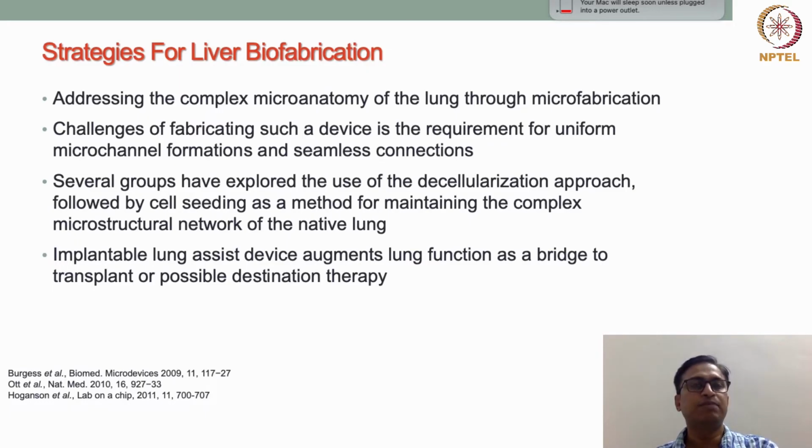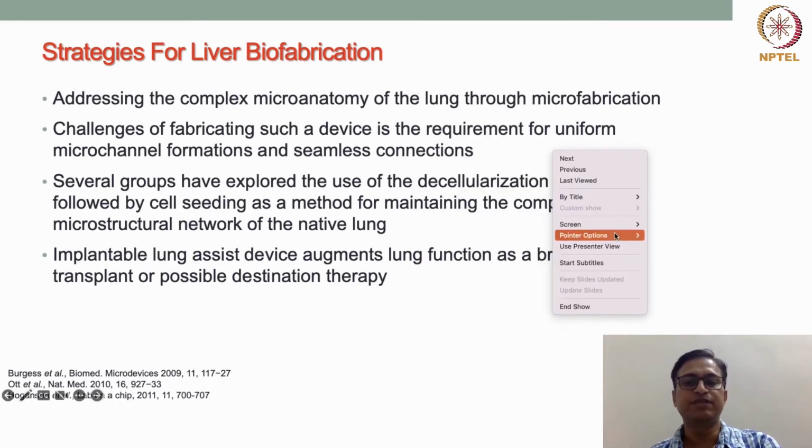But the major challenge here is cell seeding. When we decellularize the tissue, there is a little contraction of the extracellular matrix, and there is no open porous structure in the tissue, so cell seeding is very challenging.